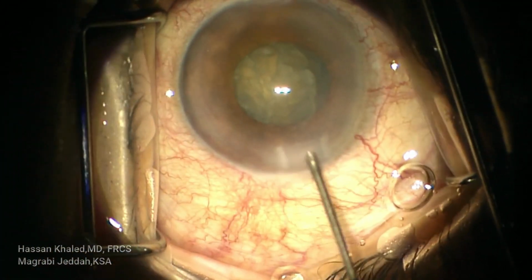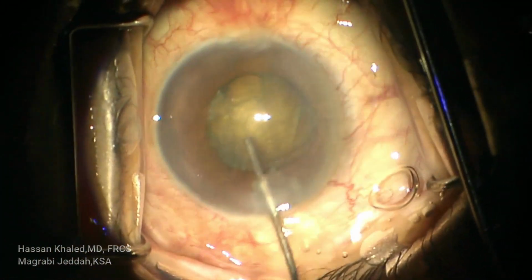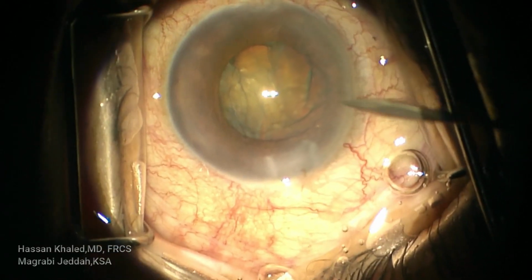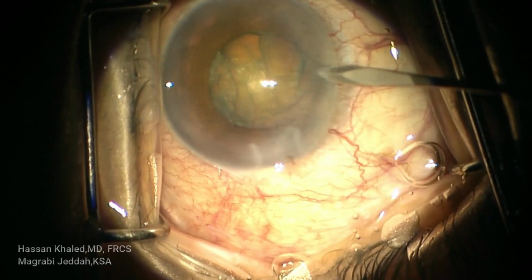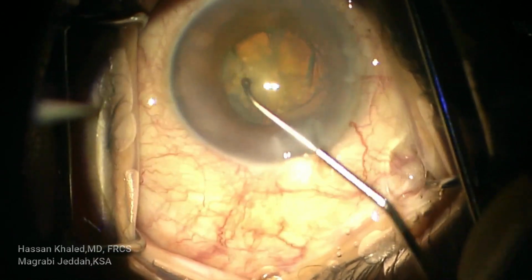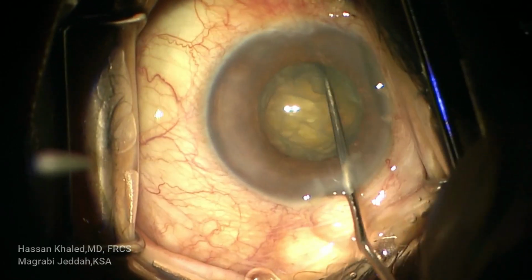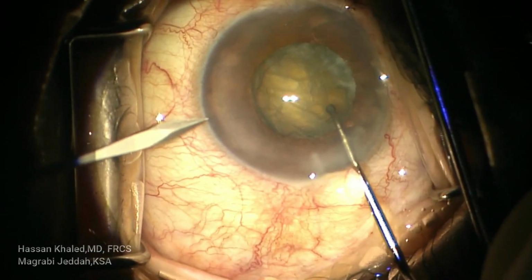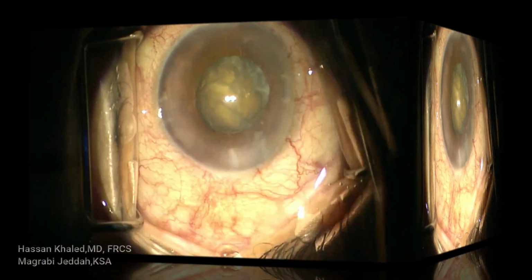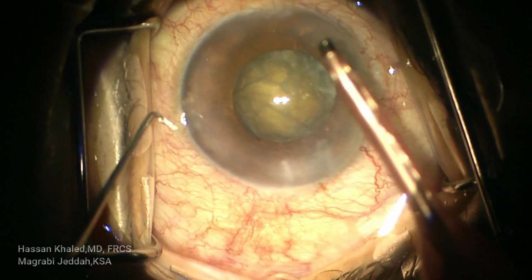Now we can also repeat the viscodilatation, also viscodissection, to lift the cortex and the epinucleus away from the nucleus. You can see the nucleus now, and you can use the secondary instrument to rotate the nucleus to be sure that your nucleus is free and your hydrodissection is excellent.